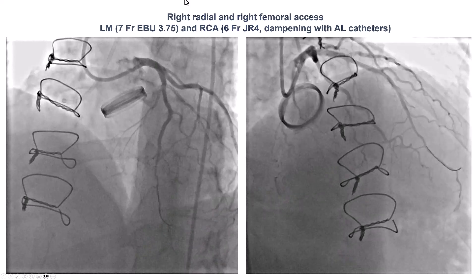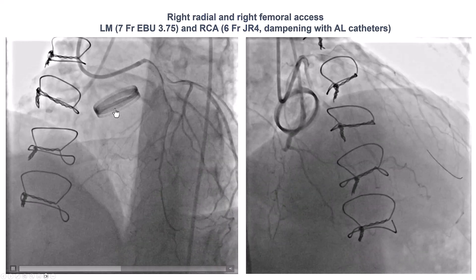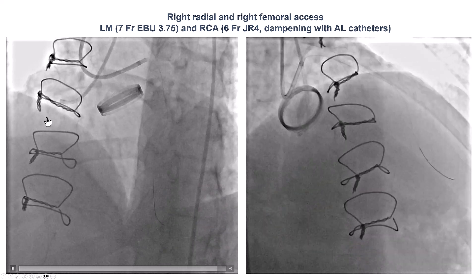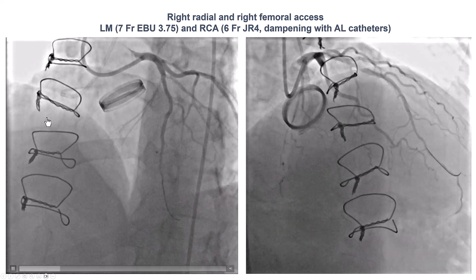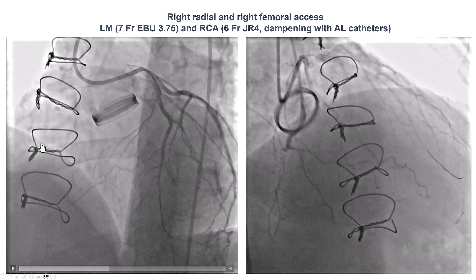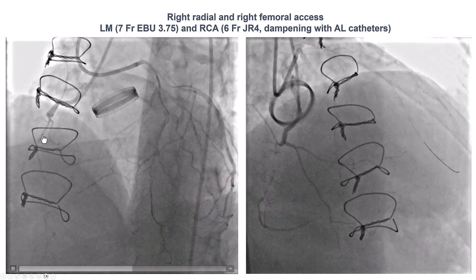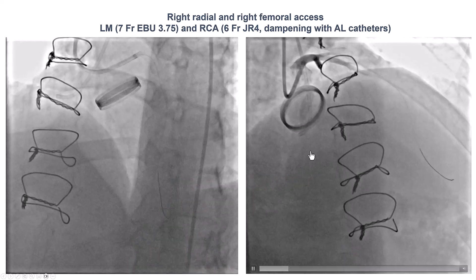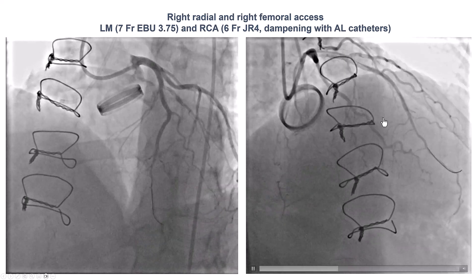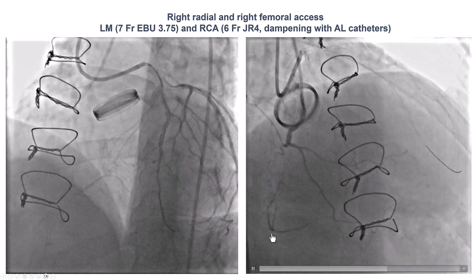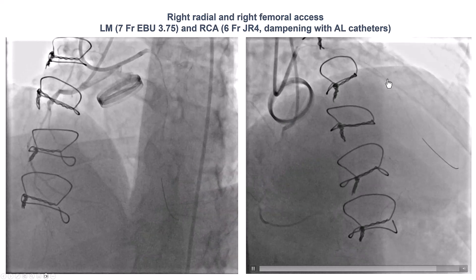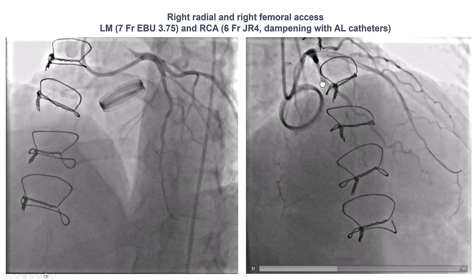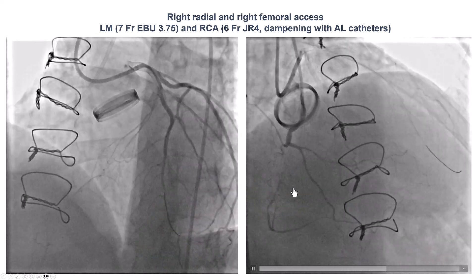This is the coronary angiogram. There is a metallic aortic valve. We do have a CTO of the proximal right coronary artery. There is a relatively long occlusion length of 30-40 millimeters, diffusely diseased distal vessel, and there are some collaterals feeding the distal right coronary artery. However, it's hard to visualize a continuous connection coming from the septals to the posterolateral.